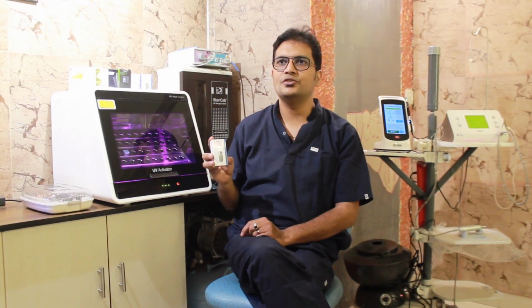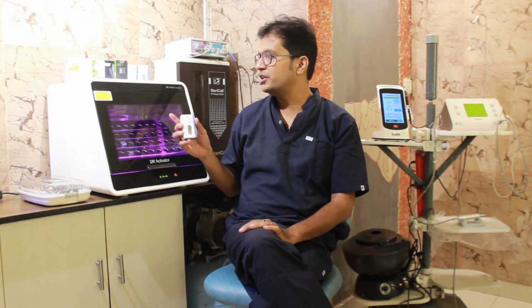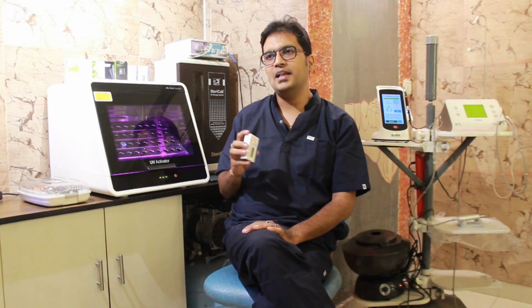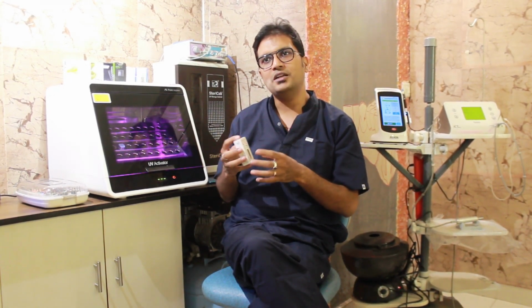Let's show you what a UV implant is. This is basically a UV implant. The main advantage of this UV implant is it gets activated when we keep it in this UV cabinet. This implant stays in the UV cabinet for 24 hours, and thus the surface of the implant gets charged, which helps it convert itself from a hydrophobic implant into a hydrophilic implant.